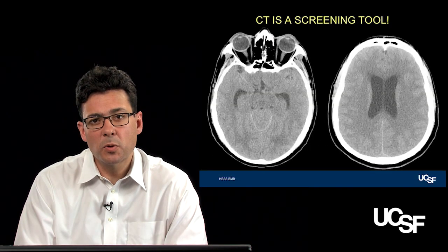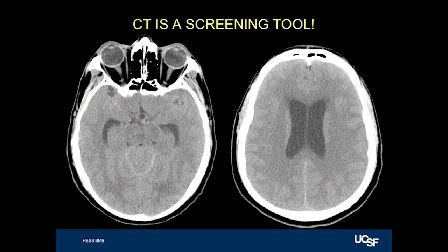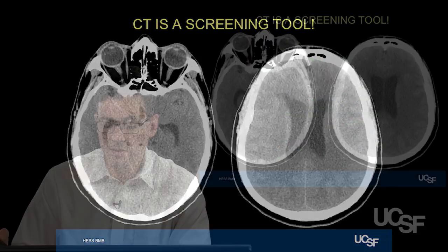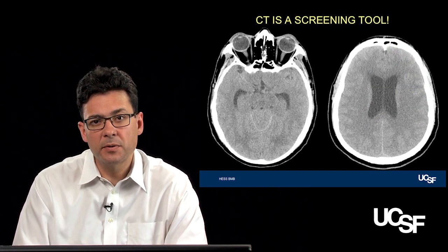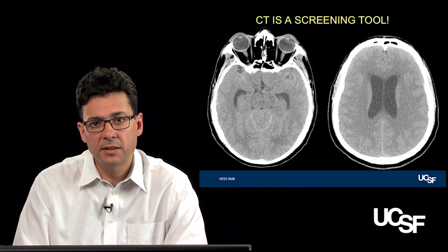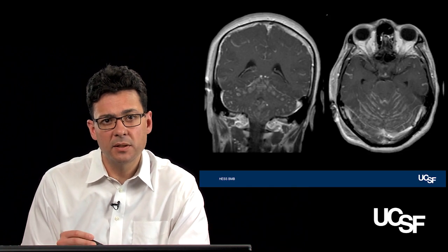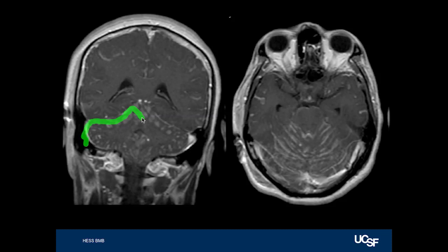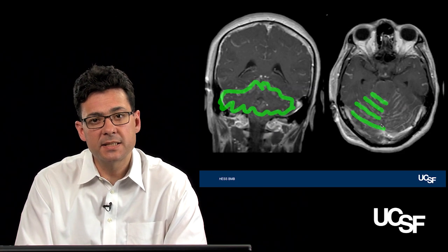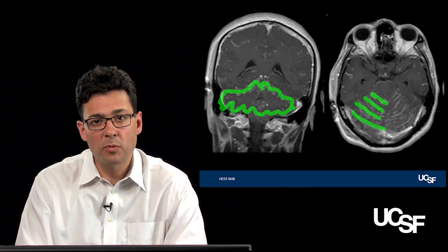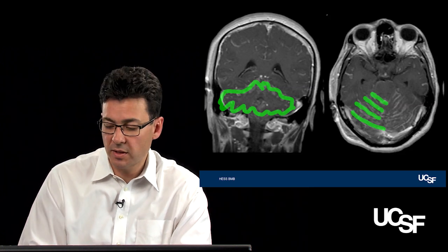Keep in mind that when a CT is normal, the patient can still have a significant abnormality. Here I'm showing ventricles slightly out of proportion to the sulci, suggesting hydrocephalus — and indeed there is. The ventricles are much larger than the sulci, and I'm not seeing the normal interdigitating sulci. But why does the patient have hydrocephalus? To answer that, I need MRI. On a post-gadolinium T1-weighted image, I see extensive abnormal enhancement within the leptomeningeal spaces around the brain, acting as an obstruction to normal CSF flow and causing communicating hydrocephalus.